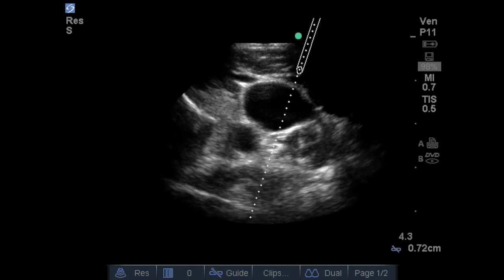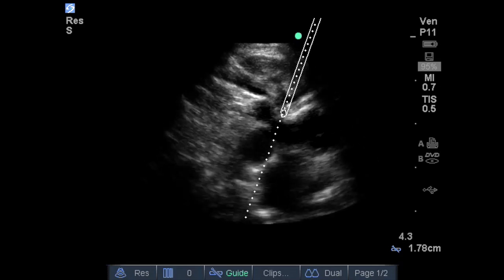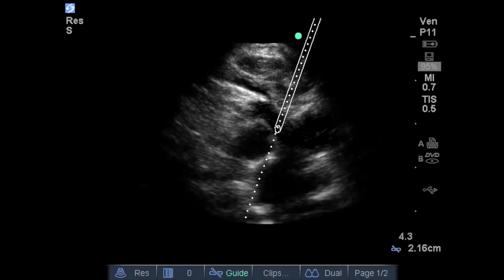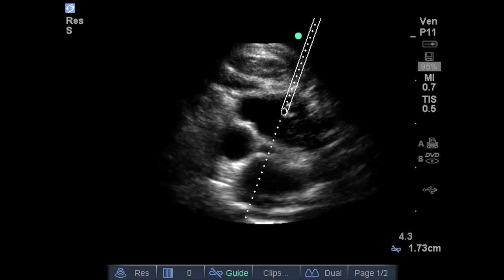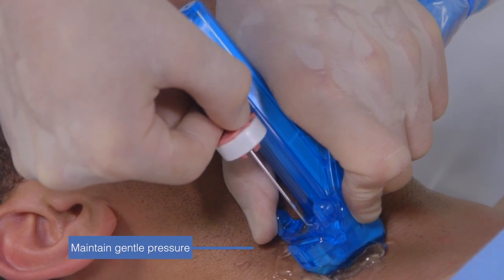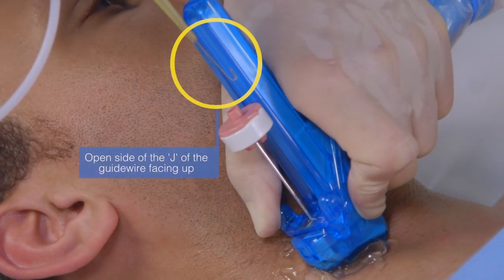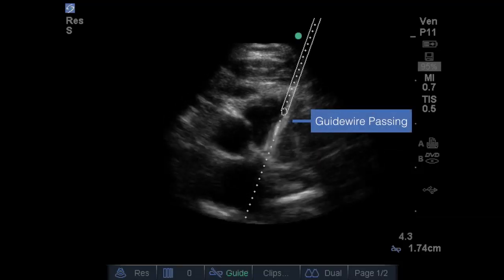The needle is further advanced to the vein under observation. The anterior wall of the vein may deflect or even fully collapse under the pressure of the needle tip. If this happens, slow down and gently add pressure until the vessel is pierced. The anterior wall will spring back once it is punctured, which can be confirmed by blood flash in the syringe. The position of the needle tip is adjusted if necessary so that it is in the upper half of the lumen and the needle clamp is actuated to secure the needle tip in place. While maintaining gentle pressure on the needle clamp, the syringe is popped off of the needle and the needle bevel position is checked to be up. With the open side of the J of the guide wire also facing up, the guide wire is advanced into the vein. The guide wire entering the vein can often be observed in real time on the sonogram.